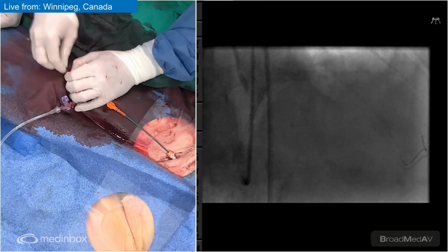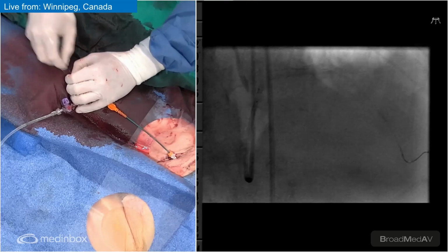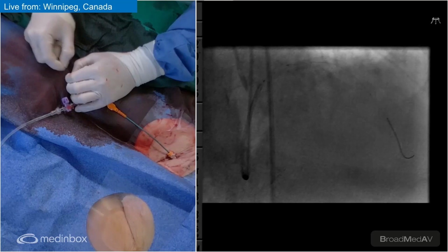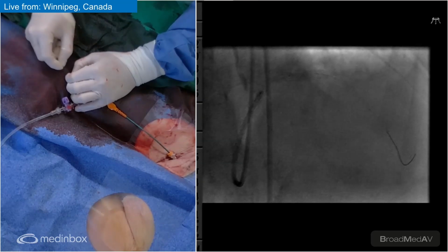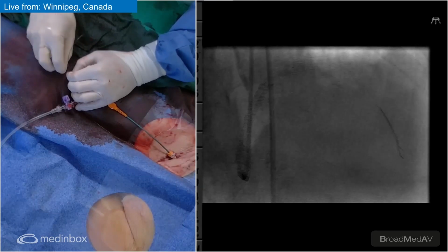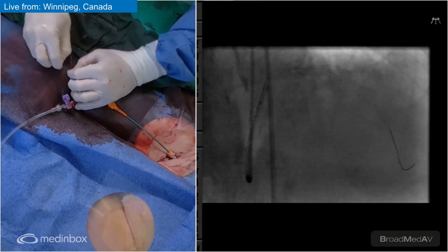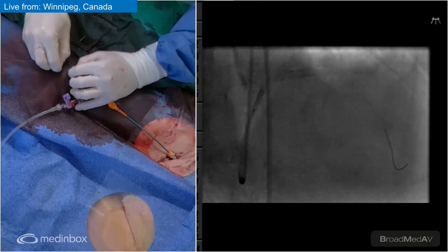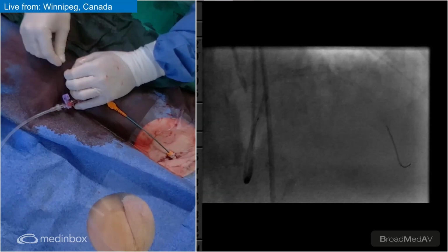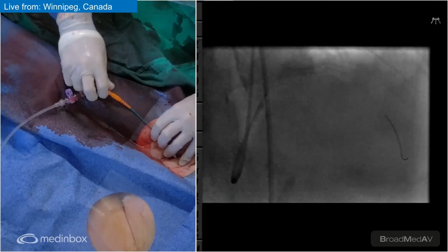Let's see. It does need that traction to straighten it up a little bit to bring the RX part down. As I do that, it does make a difference. Let's see. Now it's the part. Looks buckled. No, it doesn't want to go. I think you're buckled in the aorta. Let's see if I can change the angle of the guide, maybe. Pull it up and clock it. Looking good. Let it free fall a little bit. No, it just buckles more. Looped in the aorta.